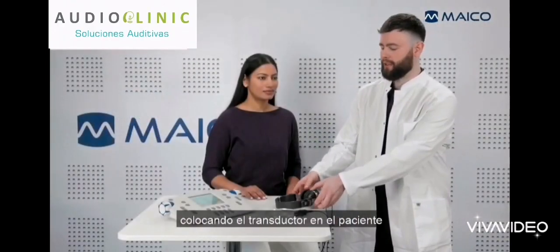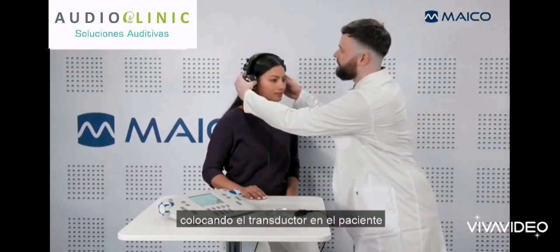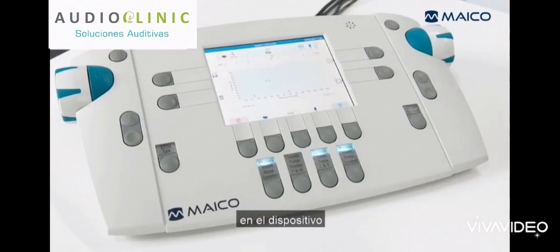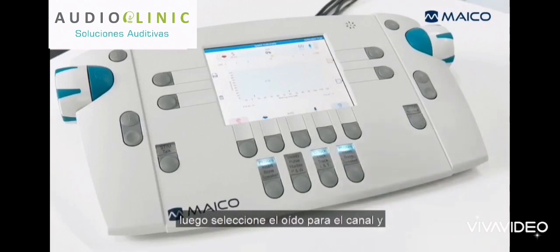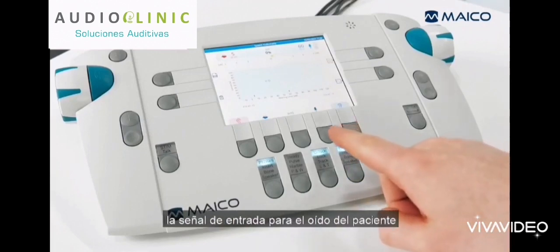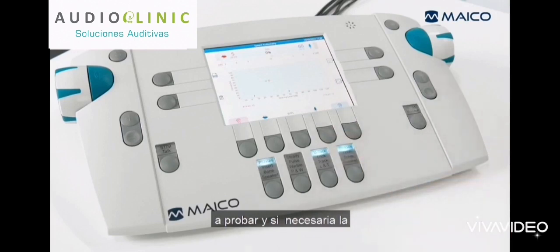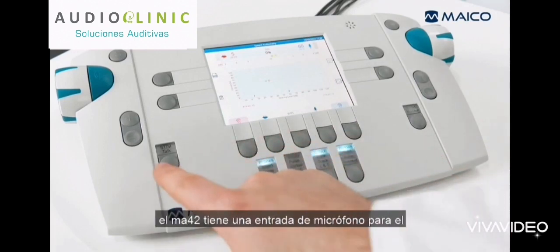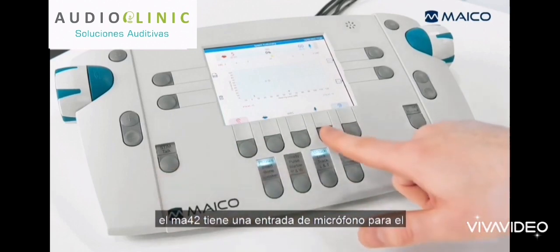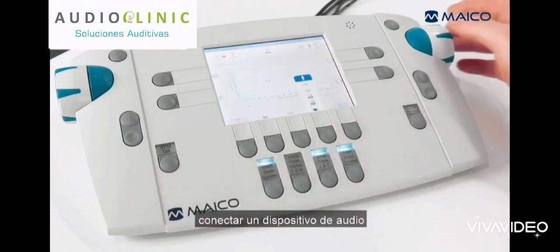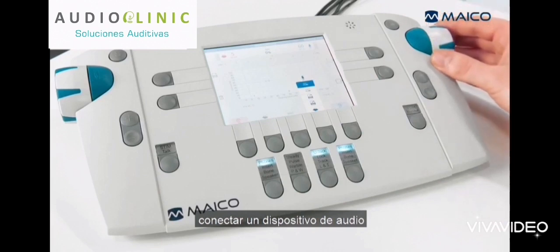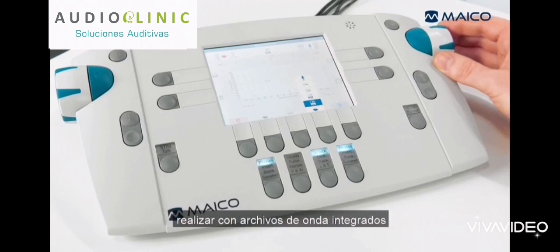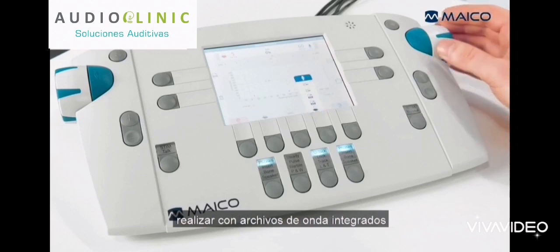Prepare the patient for the test by placing the transducer on the patient and selecting the corresponding transducer on the device. Then select the ear for the channel and the input signal for the patient's ear to be tested, and if necessary, the masking signal for the other ear. The MA42 has a microphone input for live speech and an auxiliary input for connecting an external audio device. In addition, speech tests can be performed with integrated WAV files.